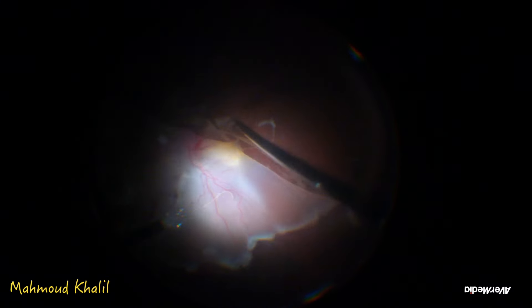Exploring the area of the macula and finding that there are small subretinal bands. When working in this area, try not to hit the retina and not to touch the back surface of the macula, so as not to damage the photoreceptors at this site. Also, avoid damaging the RPE underlying the photoreceptors in the macula.